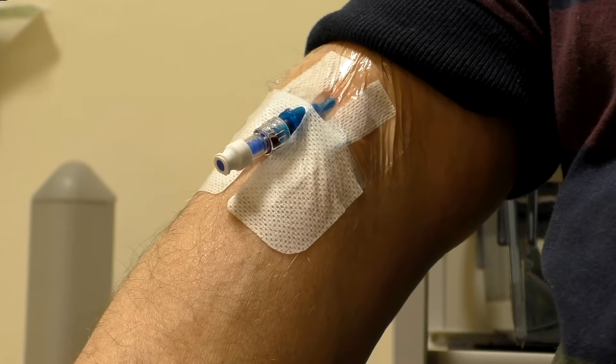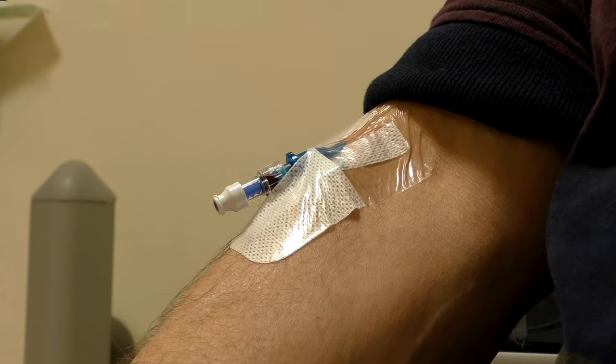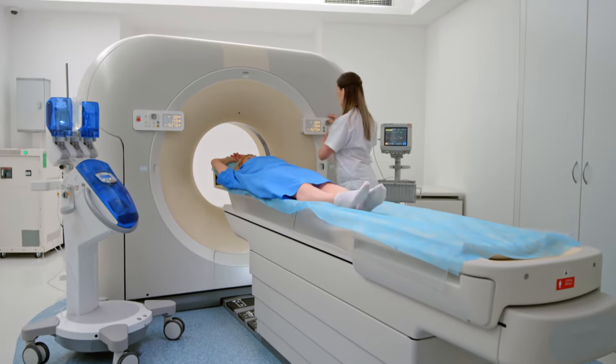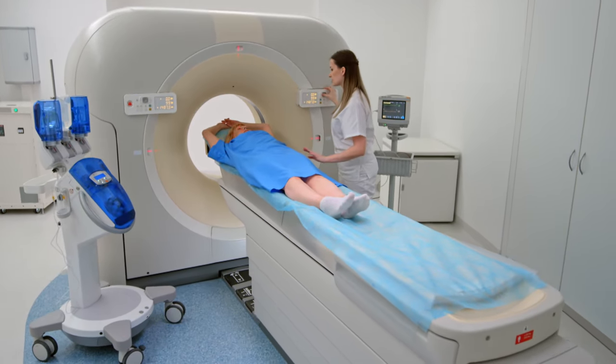The cannula also gives us intravenous access to give you beta blockers if we need to slow down your heart. You may also have been prescribed a beta blocker for a few days prior to the scan to bring down your heart rate. Once you're in the scan room, you'll be asked to lie down on the scan bed and you'll have sticky dots attached to your chest so we can monitor your heartbeat.